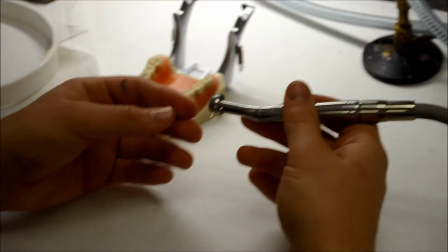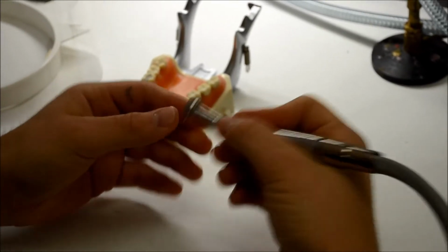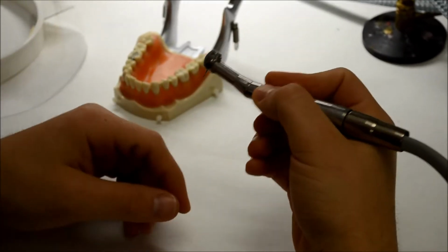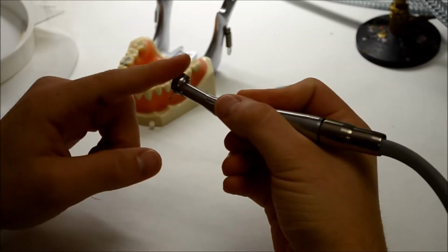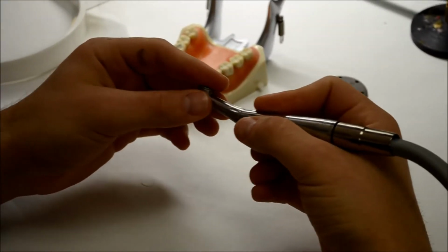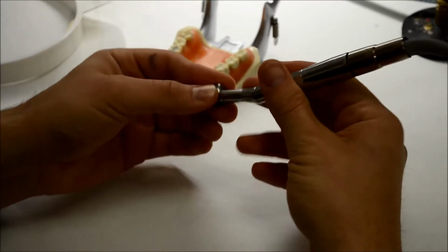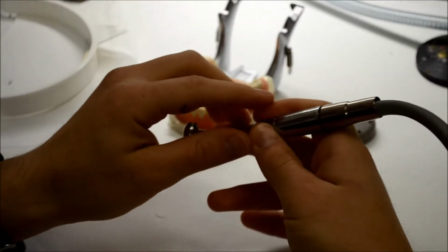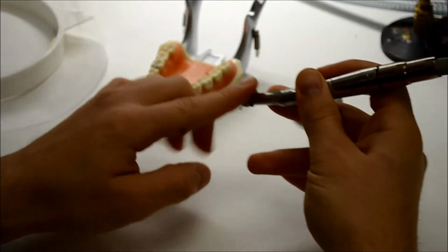So one of the most important things while drilling is to have the proper grip. Without the proper grip, you won't have adequate control. So everyone's used to writing with a pen like this, but while drilling, this isn't really a good grip because it doesn't afford you that much mobility or stability. Look, when I push the drill like this, it moves a lot. So what we use is called the modified pen grasp, and that entails moving your middle finger closer to the head of the burr and your index finger a little bit further back, so it's almost like a tripod. And that way I can move it around pretty well, and it's really stable.